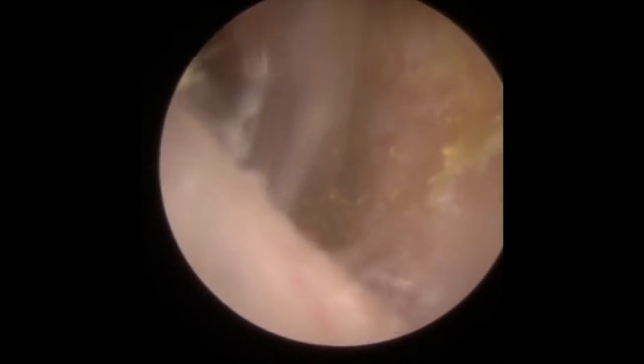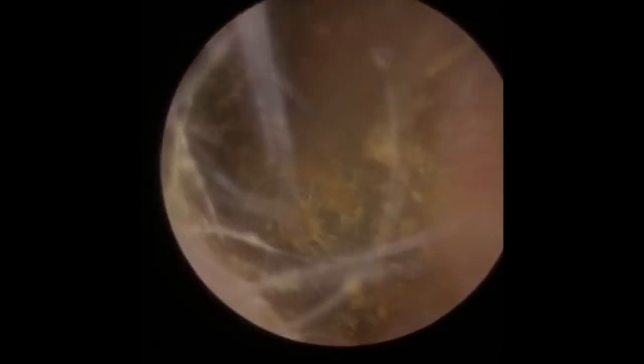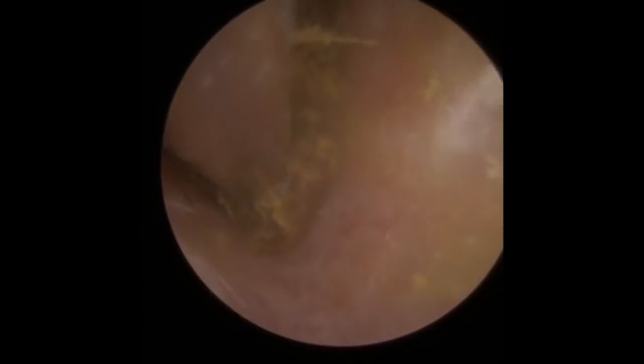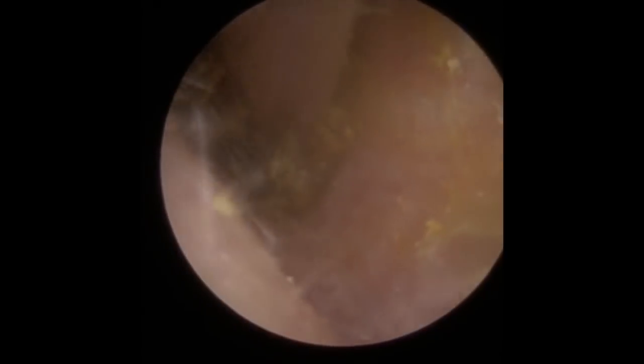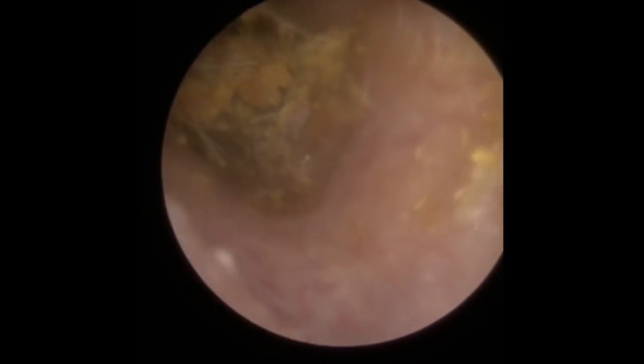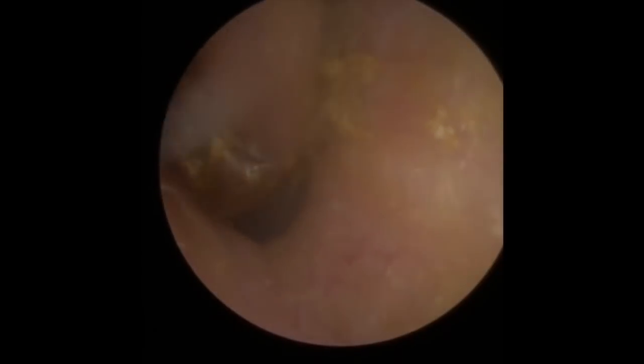So we've got a deep piece now. Same again — working at the bottom, unsticking it there first, lifting it, getting a little bit of movement. A piece sheared off so we're just going back in. Quite a hard plug this last bit. You can see most people have this kind of little valley at the bottom — a pinching at the bottom of the canal there. So I'm using the Jobson horn and the Zollner tube to hold on to this wax and try and manoeuvre it outwards. Lifting to unstick it — now we're starting to unstick and I can see the sheen of the eardrum underneath as well.